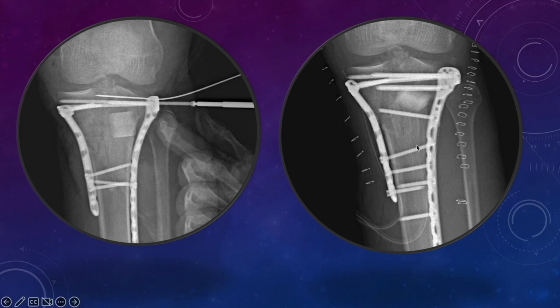And in the literature also, there is no significant difference between placement of the bone graft substitute versus a fixation without bone graft substitute or bone graft. So that's all personal choice. If you want, you can do it, otherwise it's not needed. Cancellous bone, if there are no major risk factors, heals very well.